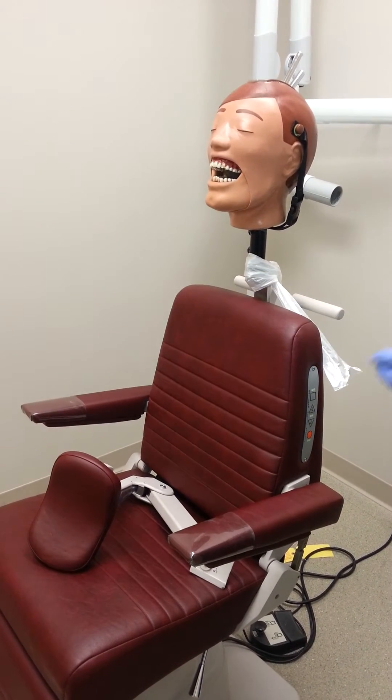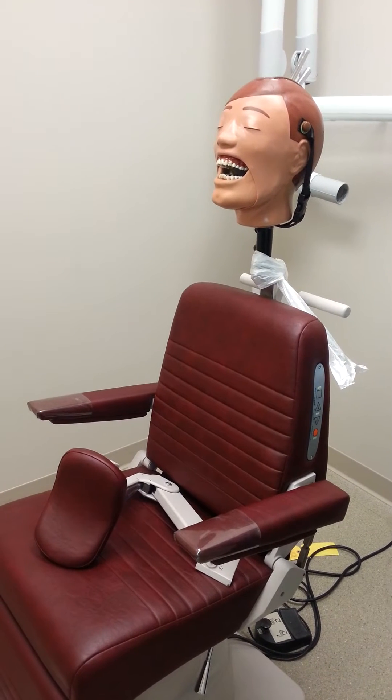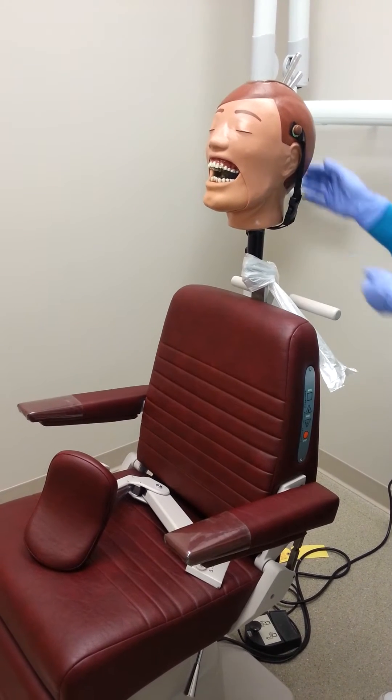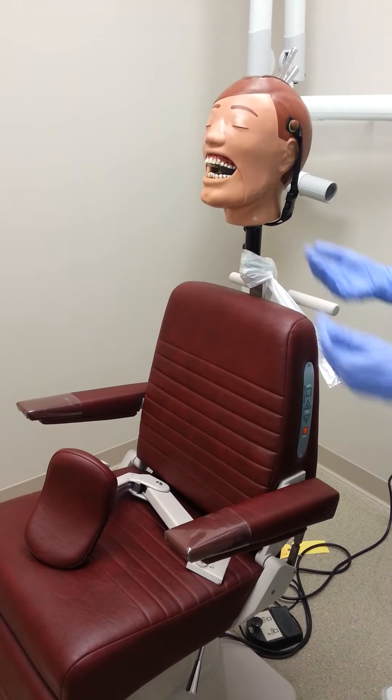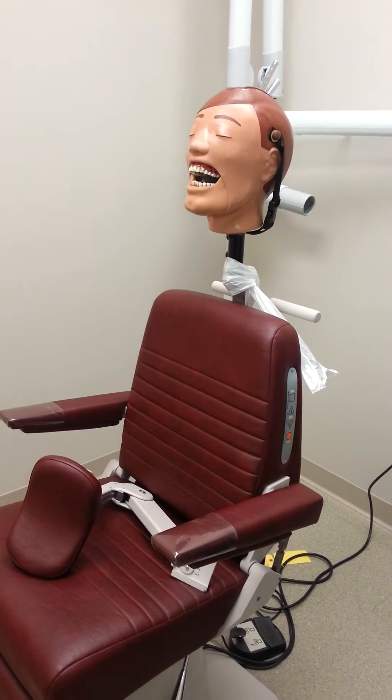Once the patient's chair is bagged, we can go ahead and place our patient. When our patient is seated, we need to make sure that their head is fully supported and that the patient chair is at optimum operator's height. We also need to place the thyroid collar around the patient's neck.